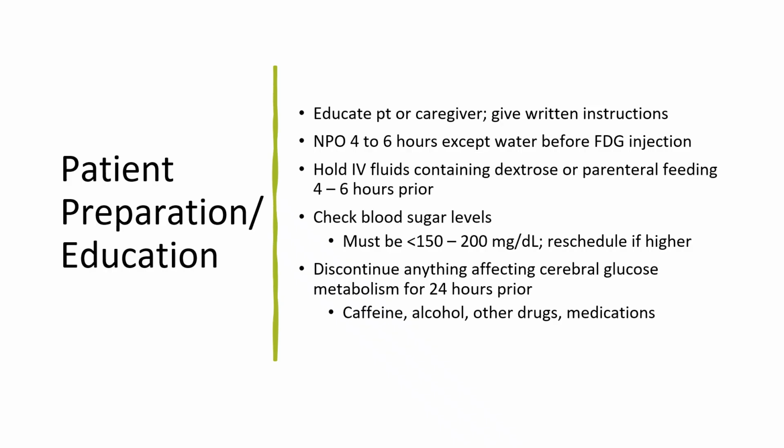And then they also need to discontinue anything that could affect their glucose metabolism for at least 24 hours prior to the test. So that includes caffeine, alcohol, any other drugs. Some things are over the counter, some prescription or legal medications. And then just avoid anything that's going to impact their glucose uptake.